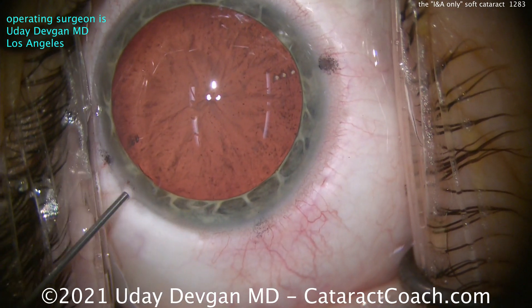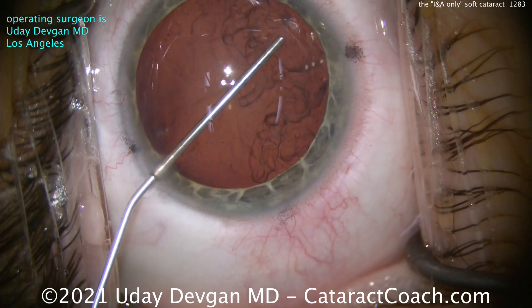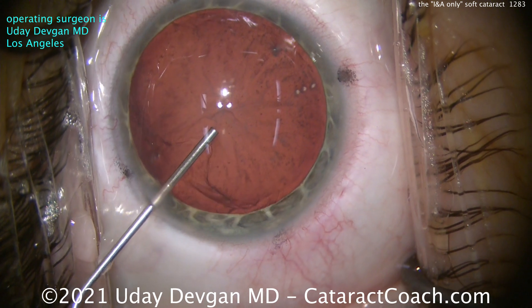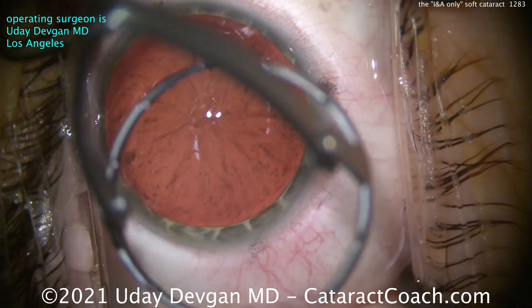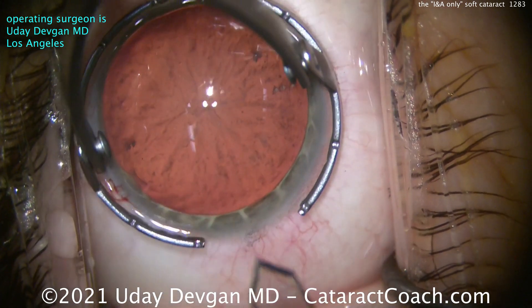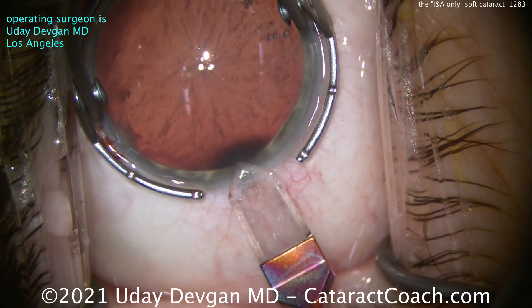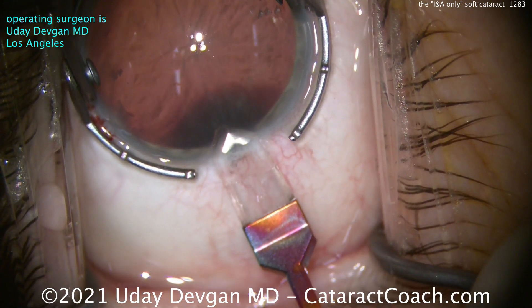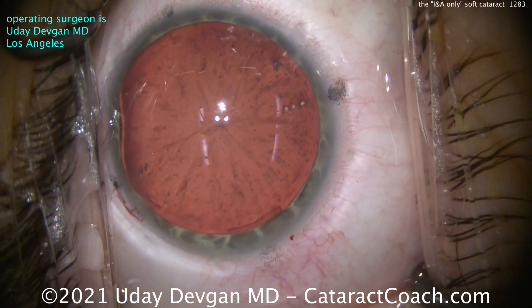The patient's other eye, the left eye, we did LASIK for and gave her a nice, beautiful, plano outcome — she's very happy. But this eye, when we examined her, we noted all these lens opacities. There was a history of some sort of trauma about 10 years prior. The patient's best corrected vision in this eye was only about 20/40, and there are a lot of glare-related issues due to the cataract. So it didn't make sense to do LASIK on this eye. What makes more sense is to actually take out the cataract, and of course we could treat the minus 4 myopia at the same sitting.